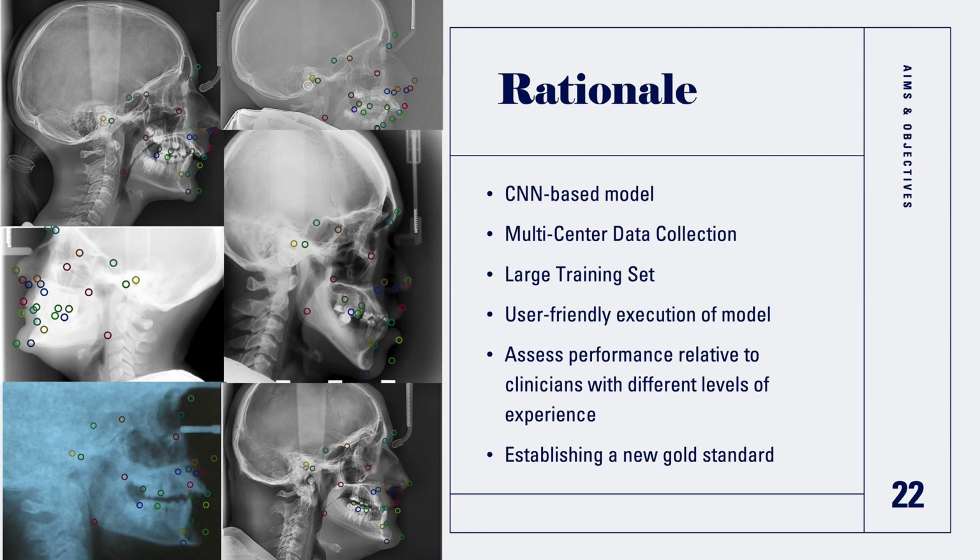So we plan to create a user-friendly web interface to execute the model on. This would offer the opportunity to obtain additional cephalograms for improving the algorithm, as well as making it accessible for educational and clinical tools for anyone interested in its use, which means we get to use it when we leave, which is exciting. And to help determine the potential usefulness of the model, we would also like to compare the accuracy of the model to clinicians with varying levels of experience. This is something that has never been assessed by prior studies.